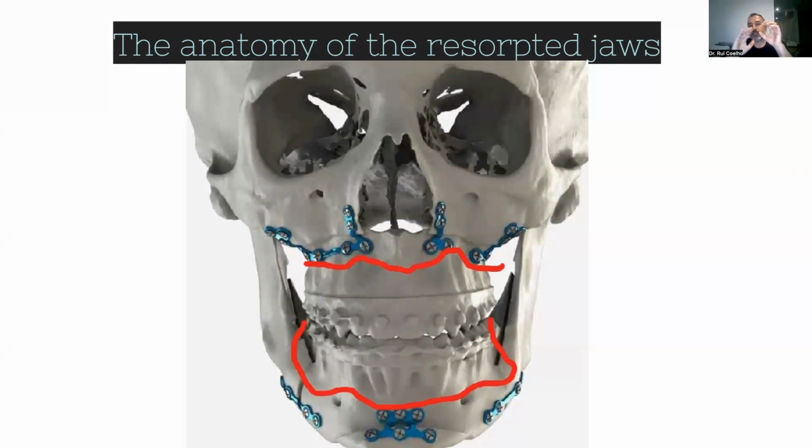The first screws will be lost immediately, of course. And then when we start to open a flap, we start to find some inflammatory tissue. But when we go deeper, what we see is that bone is growing over the plates. Everyone that has had to remove plates for some reason has already seen this. So there is a line where we have to put our plates to protect from exposure. And this line is connected to muscle insertion.